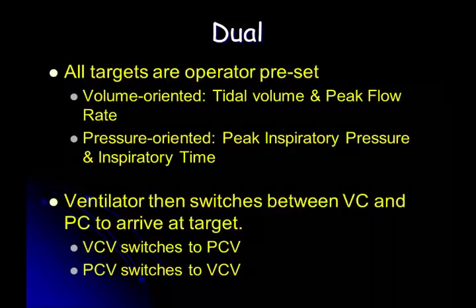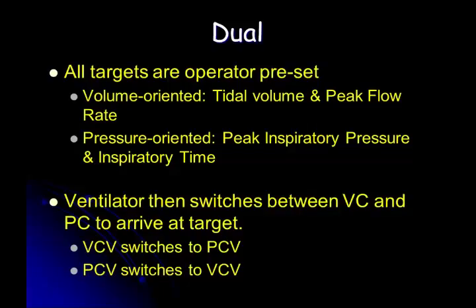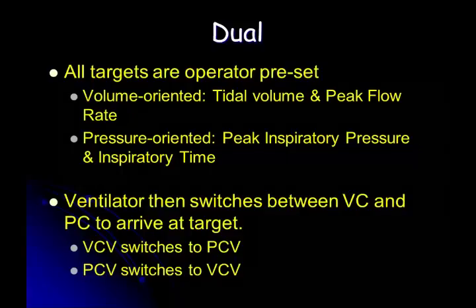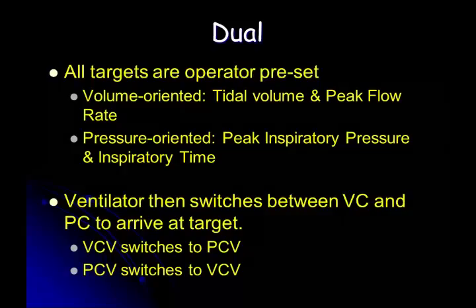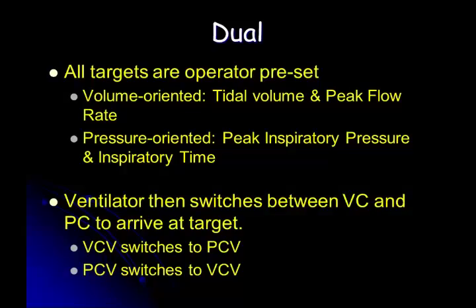Is it like an IPPB then? No, it's like pressure control, which we haven't talked about yet. Go ahead, Brian. When Dusty and I were messing around with that platform. Oh, now you're screwing up my ventilators. Go ahead. That plateau pressure, and you turn off that auto flow. Mm-hmm. Does the same.